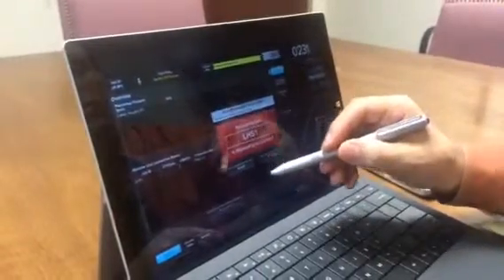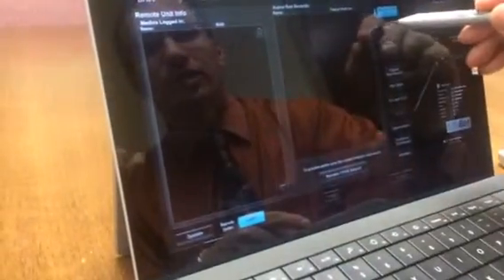So this is what you'll see when a call is coming in. All you do is click accept and click LHS1. The moment that is done, you click on video, and there we have our patient.